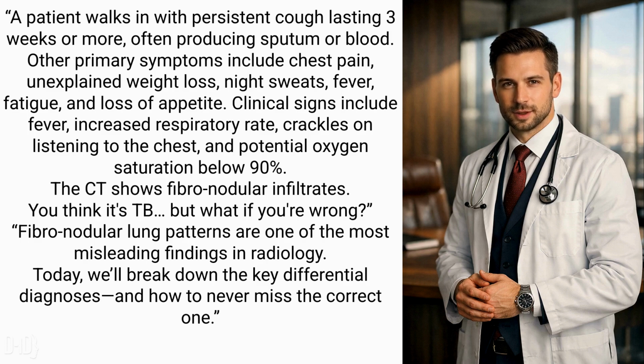The CT shows fibronodular infiltrates. You think it's TB, but what if you are wrong? Fibronodular lung patterns are one of the most misleading findings in radiology. Today, we'll break down the key differential diagnoses and how to never miss the correct one.